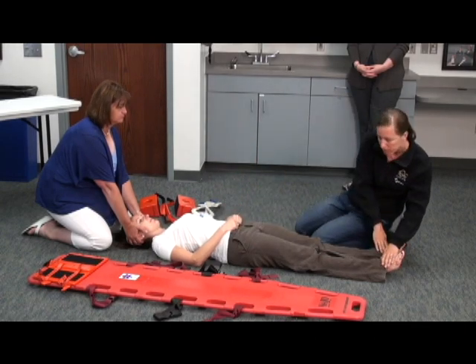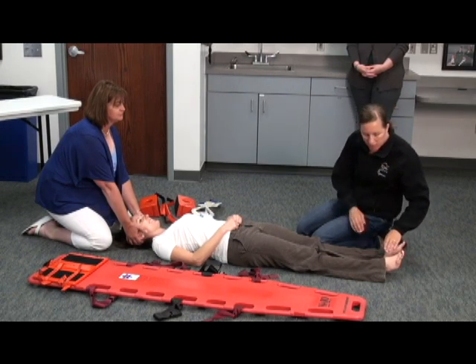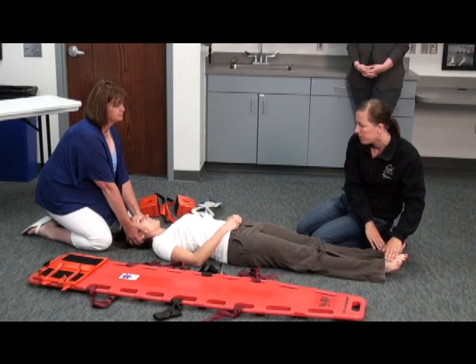And how about pedal pulses? Pulses are good. And which foot am I touching? Right. Now? Left. Can you push up on my hands? And can you feel me touching you? Yes.